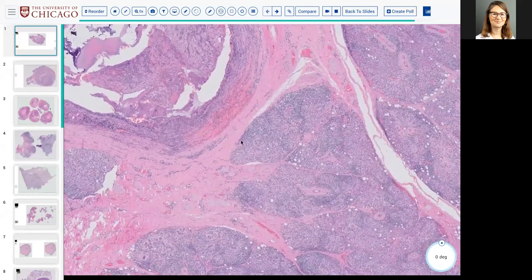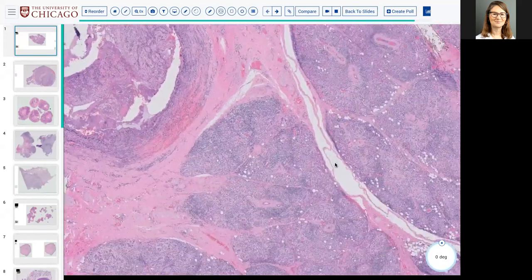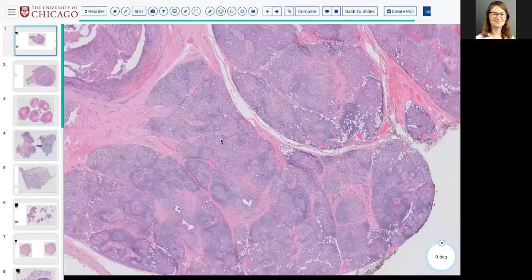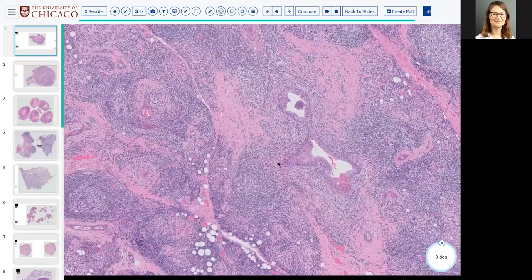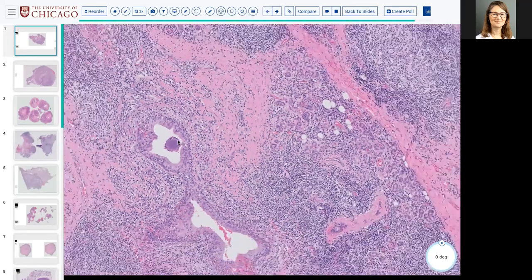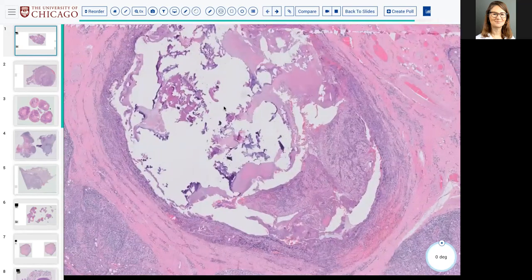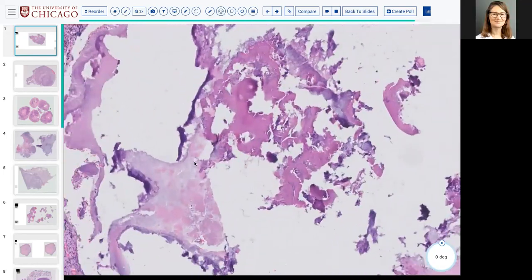Cool. Yeah. So we don't see this particular thing resected very often, so I thought it was just a nice example of a combination of two things. One, very abundant sialadenitis, with these small foci here that you may appreciate are both in the smaller ducts, as well as this very large thing in a large duct, which is a sialolithiasis. Exactly, it's a sialolith. It's a stone.